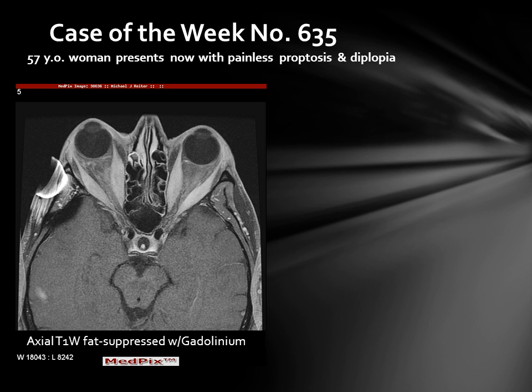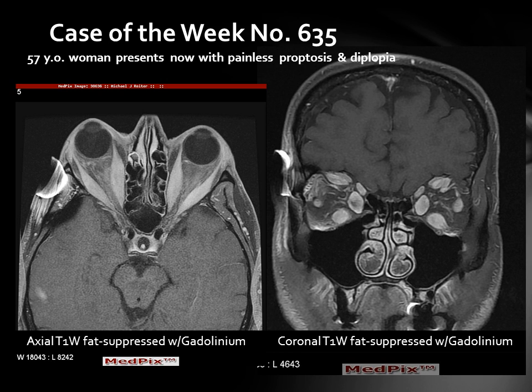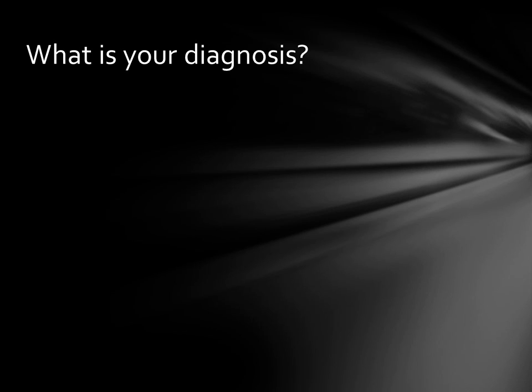Hi, I'm Jim Smyrniatopoulos and this is MedPIC's Case of the Week, number 635. A 57-year-old woman presents with painless proptosis and diplopia. We have an axial T1-weighted fat-suppressed MR with gadolinium and a coronal T1-weighted MR fat-suppressed with gadolinium. Look carefully at these two images and consider the differential diagnostic possibilities. What is your diagnosis?